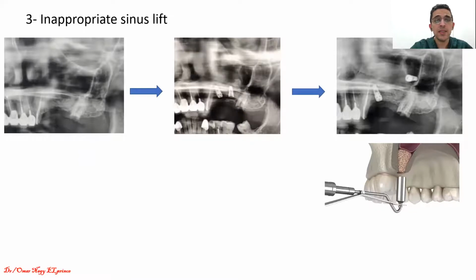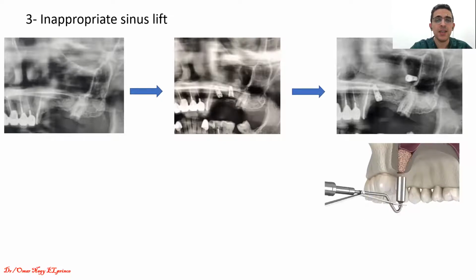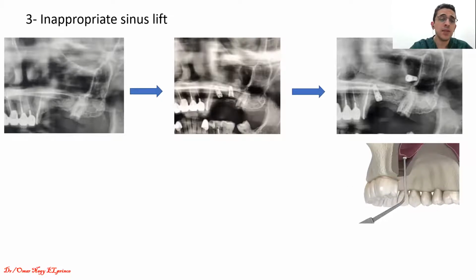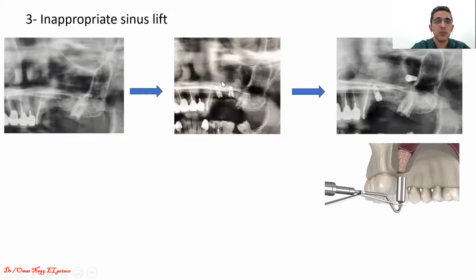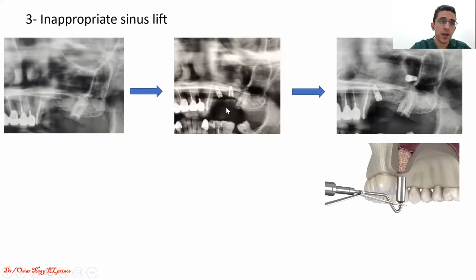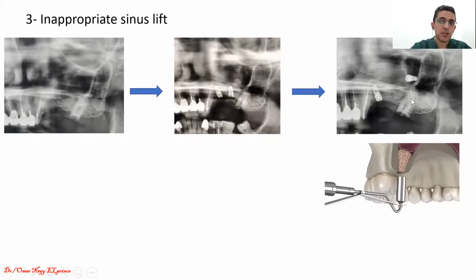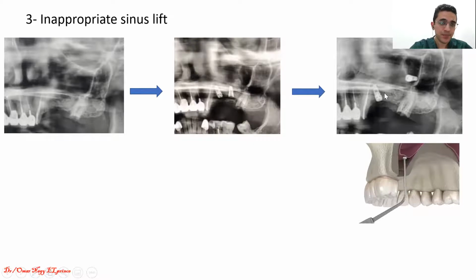The third cause is inappropriate sinus lift. يعني والكيس دي يمكن يعني انا بشوفها كتير جدا، ان يجي لي patient he tells me I did a sinus lift، وتبص في الاكس راي تلاقي ان الامبلانت موجوده، there are radio opacities which represent ان هو كان في bone graft, some kind of bone graft or something like this، وبعد كده بعد كام شهر تلاقي ان الامبلانت displaced.